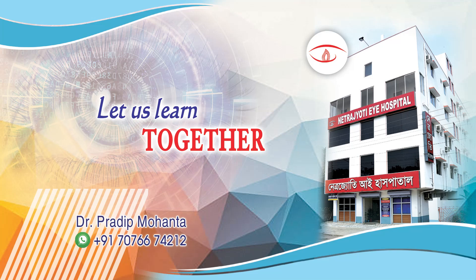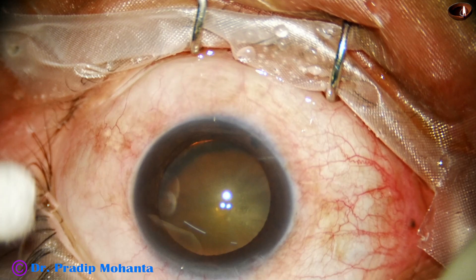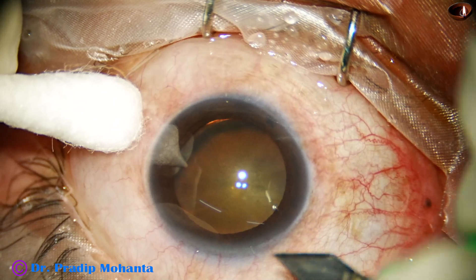Friends, welcome to my workplace at Ranadha to Spengal, India. Let us observe this surgery. This is a cataract with zonular dehiscence from 3 o'clock to 7 o'clock.